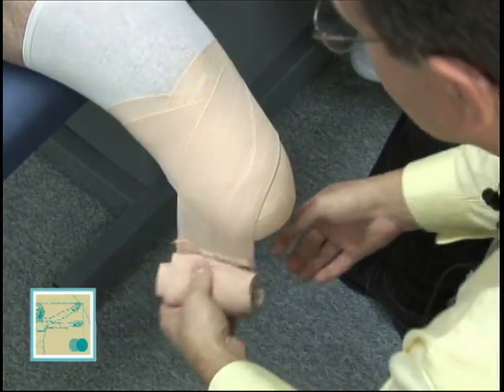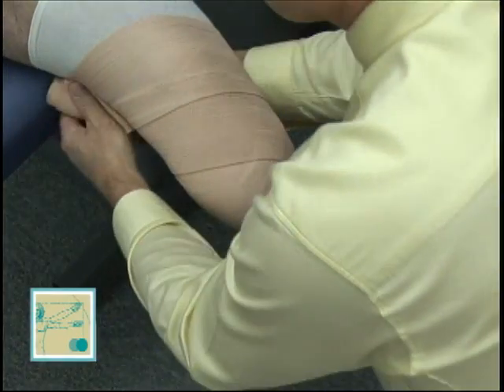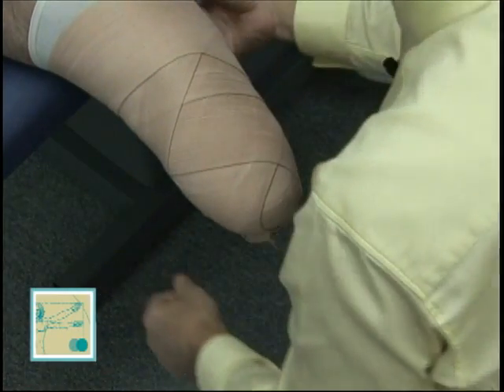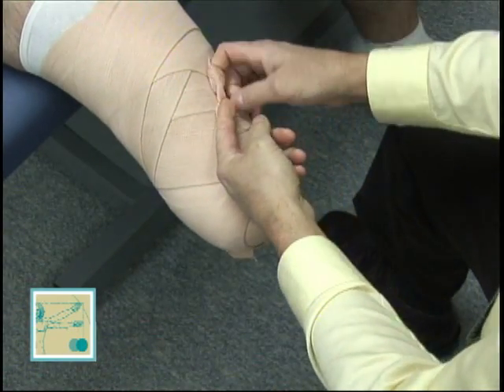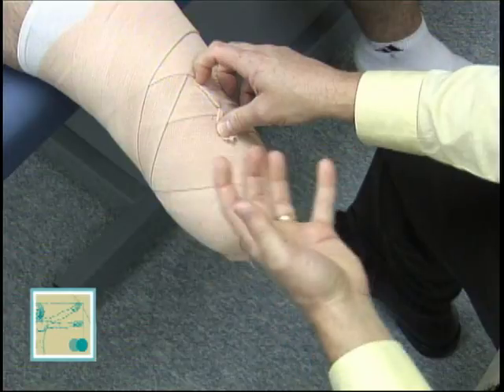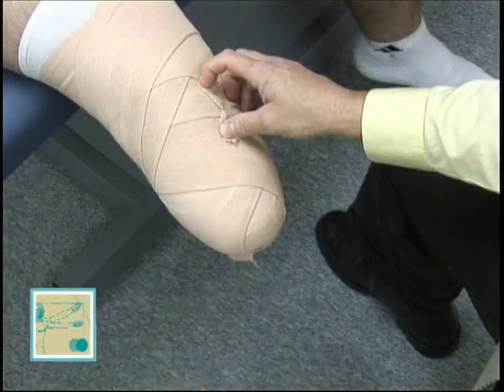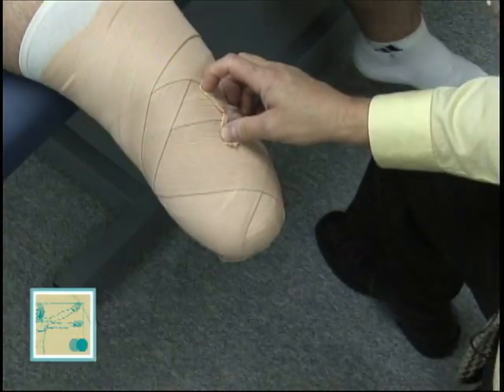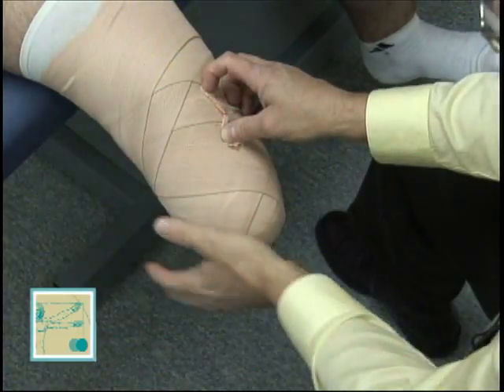On a post-operative case like this at day two or three, I may not be able to wrap it as tight as I normally would. I have to rely on what my patient tells me is the appropriate tension, because what might feel good for a half an hour by two in the morning might drive them crazy. So the next day when you see them, you may have to ask: was that wrap too tight, too loose, how was that? Then you can adjust your technique. But the principles are still the same: you want more compression distally than proximally, keep things moving in a criss-cross pattern, and improve circulation from distal to proximal.